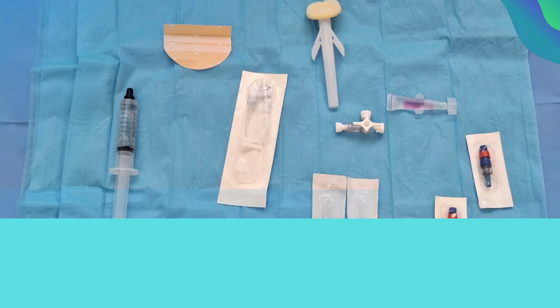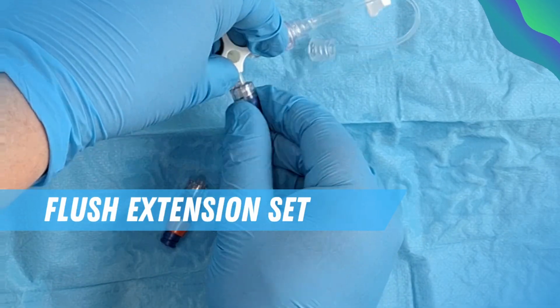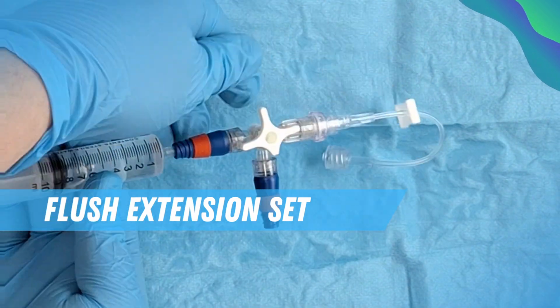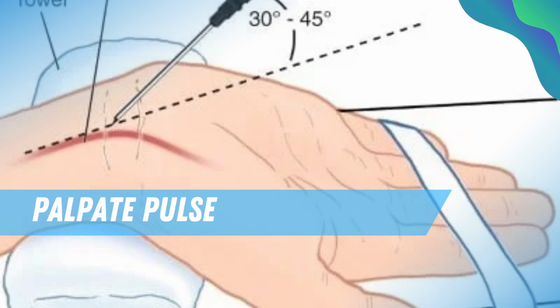Firstly, prepare your equipment. You will need at least a yellow cannula, 24 gauge, ChloraPrep applicator, a dressing and steri-strip set to secure, a flushed extension set, a 3-way tap with an arterial line connector, and a saline flush. Attach your arterial connector port to your 3-way tap and flush all lumens. Position the patient's arm with the wrist extended. Gently palpate the radial pulse.